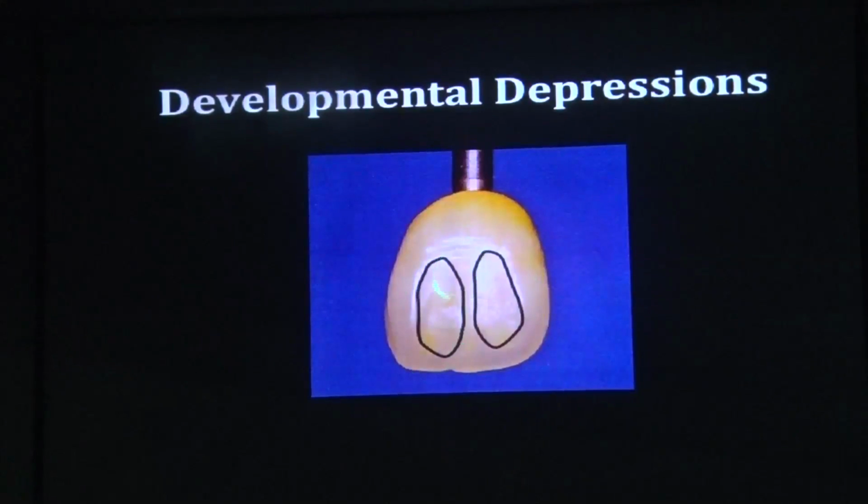Then comes your developmental depression. I am going to show you today how to give developmental depression in the hands-on. It's very simple. The easiest instrument to use is the enhance cup after you finish your gross finishing.